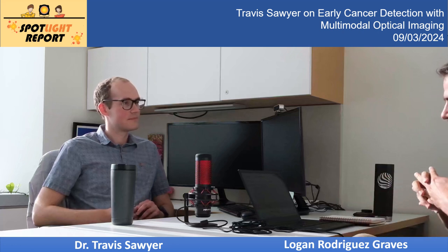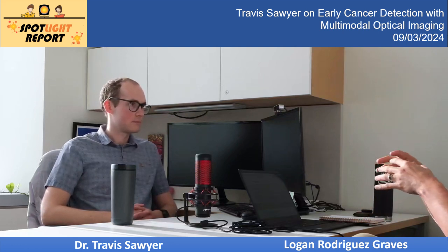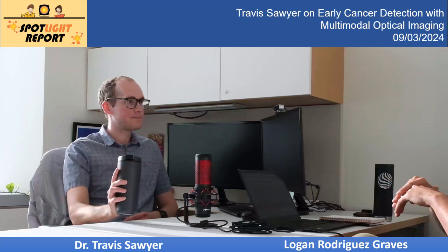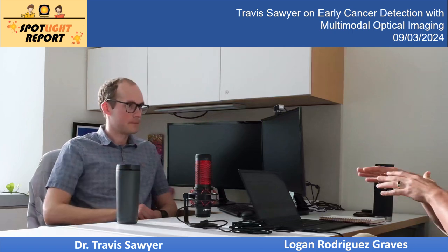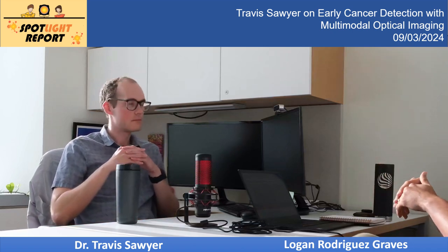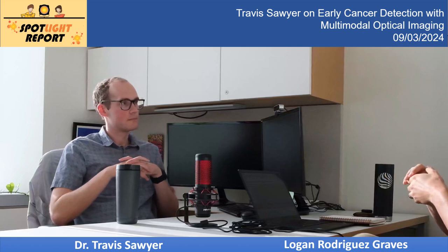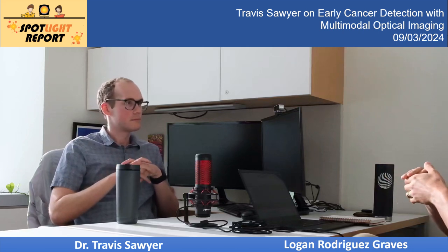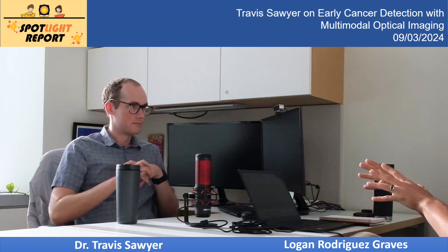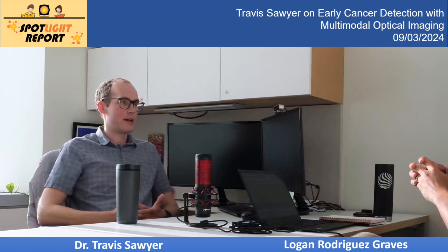I apologize. But one thing that I remember from colon cancer was that even when you get larger lesions at the surface, not that it's particularly fun to look at, when you're looking at colon cancers visually at the surface, you might not see it. Some of them look like, oh yeah, that's something, I need to take a careful look. But a lot of them don't. They might be mildly discolored if you're looking at it in the visual spectrum. There's nothing particular about the surface that really stands out. So you really cover this, that the techniques you're looking at are looking below the surface or at other spectrums. So the concept of depth under the tissue is definitely important.